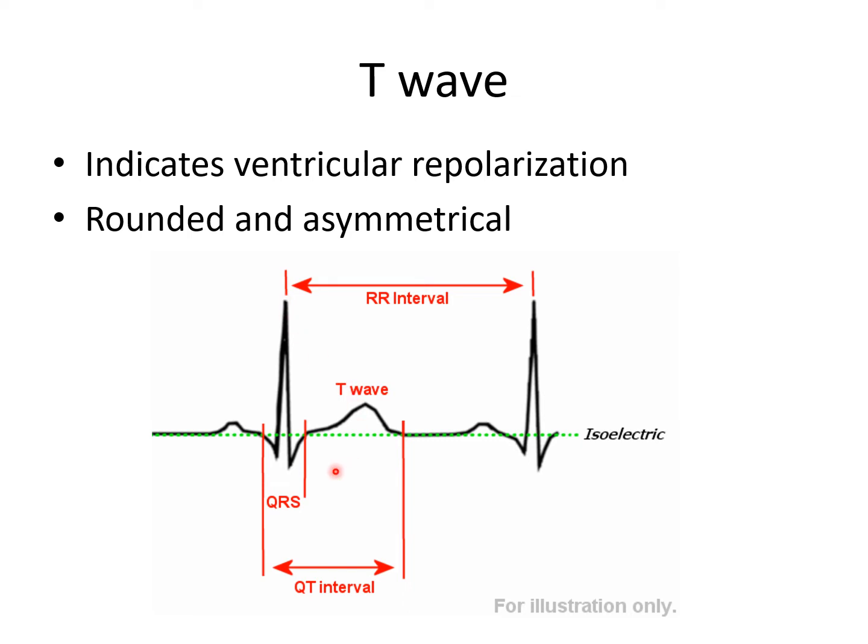It's also very nice because it shows us the R to R interval. There are times when we will ask if a rhythm is regular or irregular.